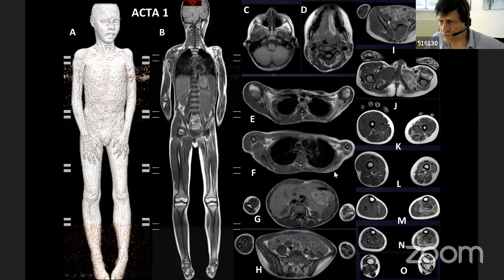On the left side, the replacement pattern is very evocative of ACTA1 disease, but it's very strange to have an asymmetrical distribution. But in this case, you have an explanation in the genetic profile of the patient. And as you can see, you can detect asymmetry in bone.